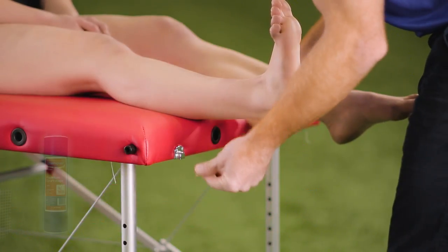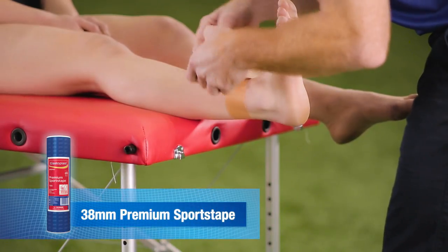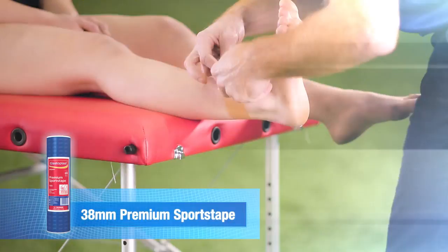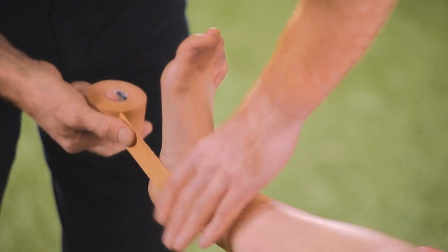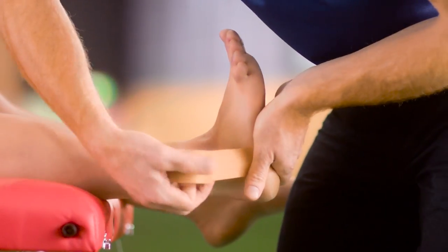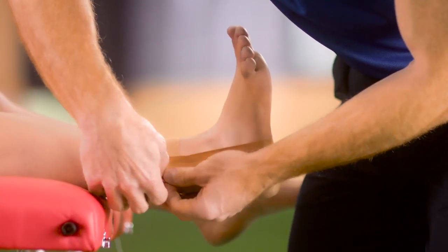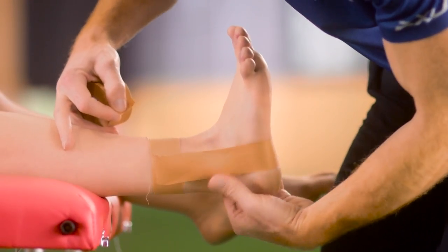Using Elastoplast rigid 38mm today to support the ankle. First, we put on an ankle anchor just superior, or above, the ankle. We then perform three stirrups from the inside or medial aspect of the ankle, pulling up to support the lateral ankle, making sure the tape is adhered to the skin on every application.